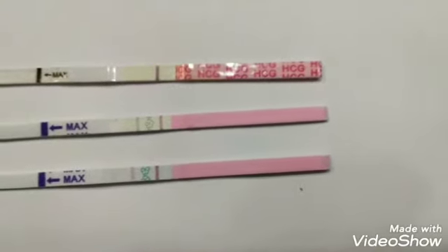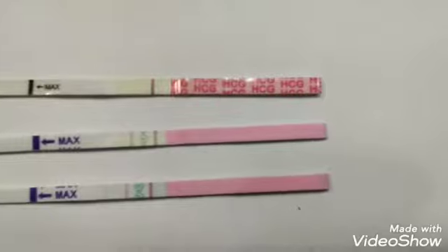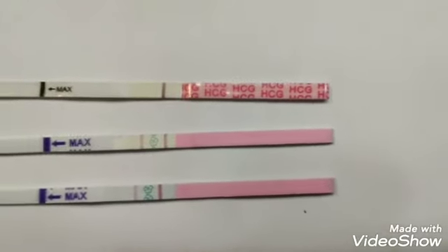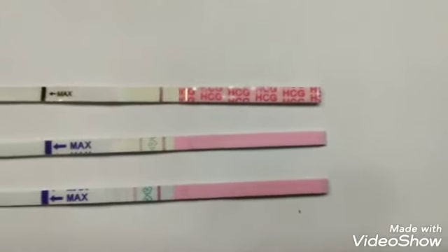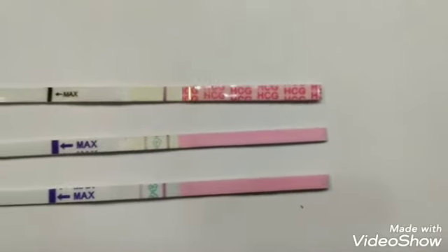So I tend to try, we usually do a couple of them. Maybe one, say, 4 o'clock in the afternoon or 3 o'clock, and then another one around 8 o'clock at night. And by the next morning, sometimes it's already over. That is my tests, and that's how I roll.